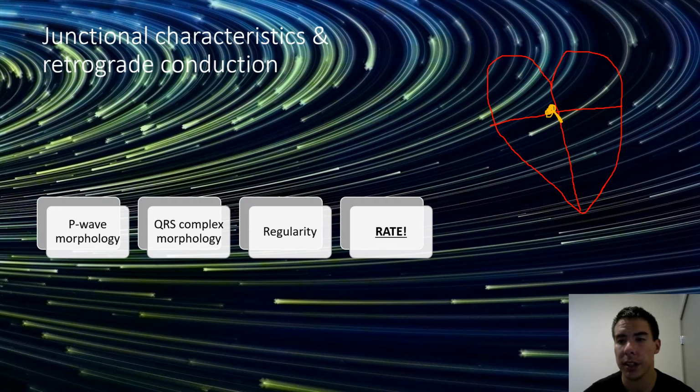But since that is lower than the atria or the SA node, the heart still needs to beat everywhere, so the impulse still needs to go up and through the atria, but it's starting lower. So what that does, if we remember the right arm lead being negative, and the left leg being positive, the vector or direction of electricity is normally in that direction, in lead 2 that is. Well, no matter what, it's in that direction, but in lead 2, that's what causes those nice upright round P waves like this.